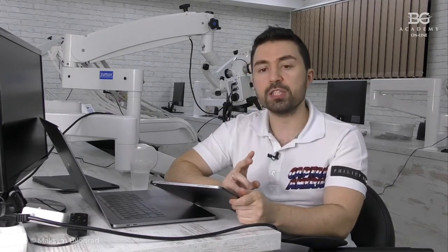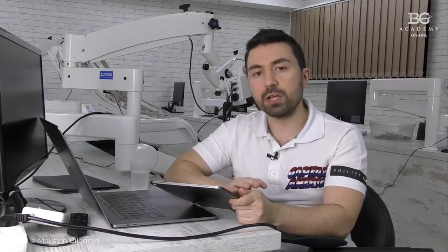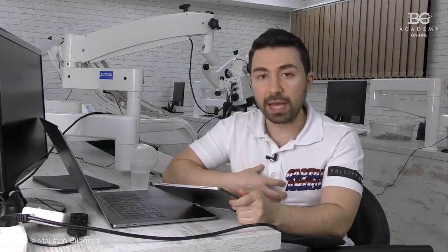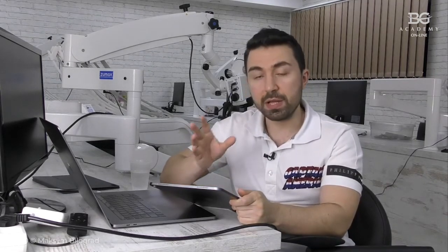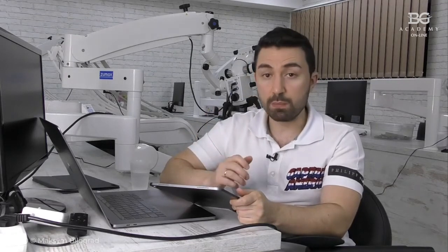In some cases, you can do a try-in. In some difficult cases, you can do a try-in just to be really sure that everything is all right, and then you can reschedule your patient for the final restorations. So what I'm trying to say is that I don't like to fix discoloration problems by cement color. We discuss with the dental tech, and we try to fix this problem with the ceramic material that my dental technician utilizes. This is our strategy, and it is much more predictable.